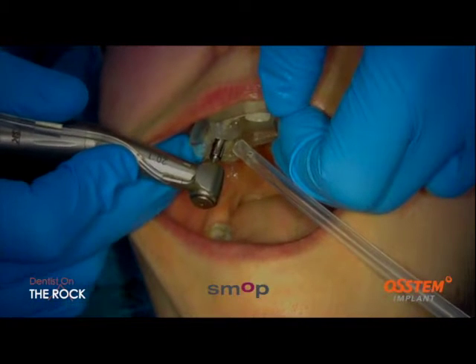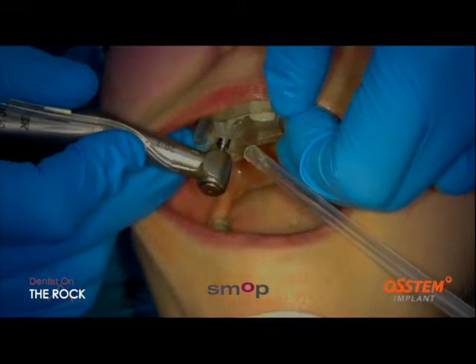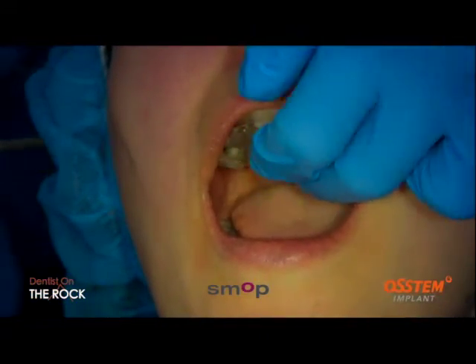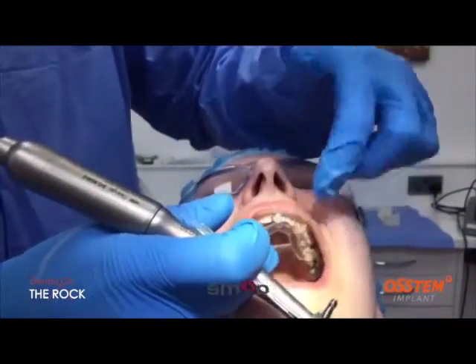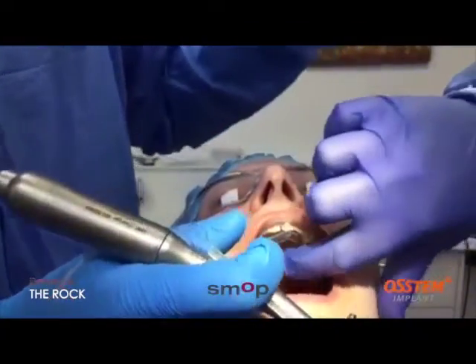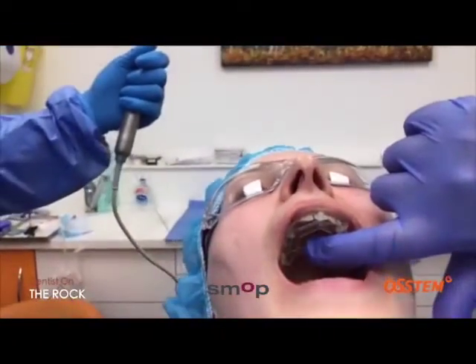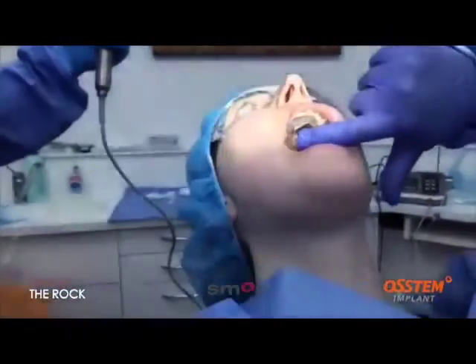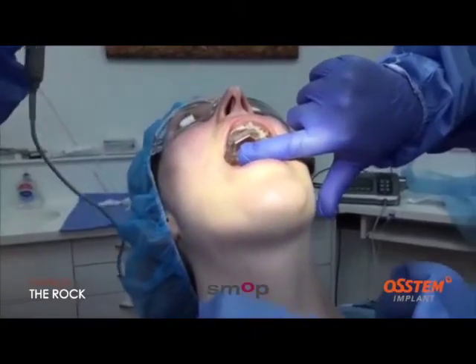So the guide should fit very, very snugly for the tissue punch. Now I'm going to try and lower this down a little bit, just to see. Can you just hold that there, Jenny, and I'll try and position this? Just put your finger there. Yeah. And try so that you can see over the top. That's better. There we go.